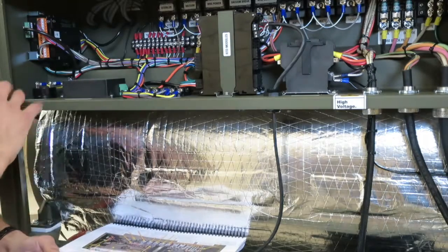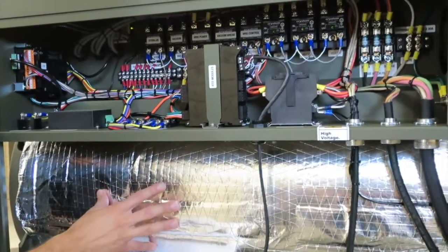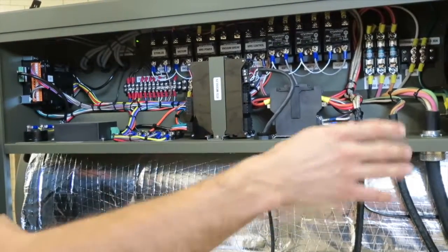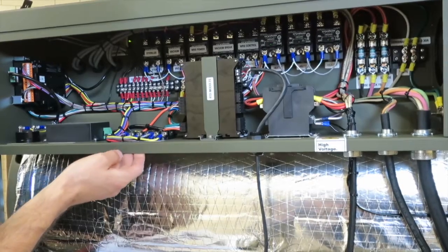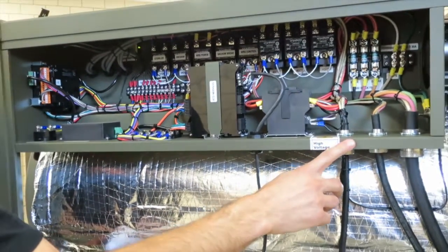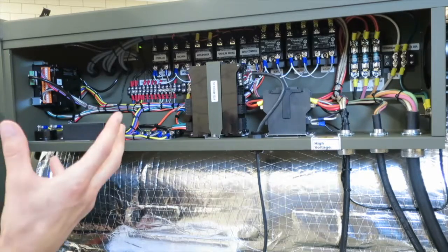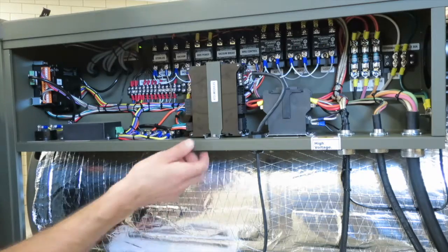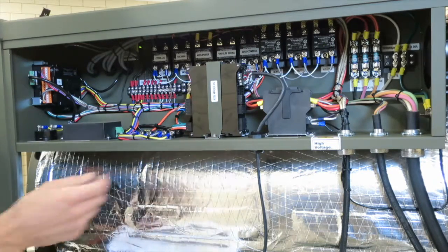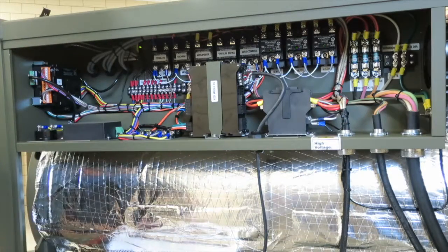Alright, now we're going to talk about the components under the right side panel. Again, this sterilizer is running, so we're going to be very careful as we point and walk through this electrical box. We do have high voltage on the right, so if you ever were performing maintenance where the sterilizer had to be on, you'd have to be very careful on this side. It would only need to be performed by trained personnel. So I'm going to start from the bottom and work my way around.